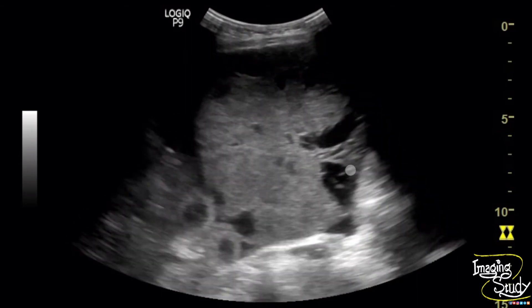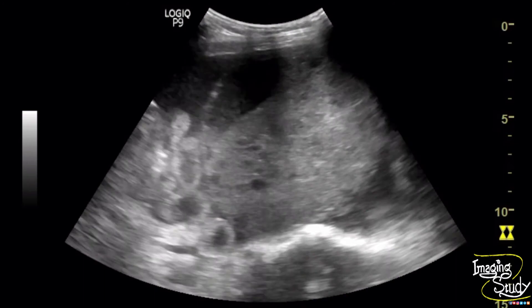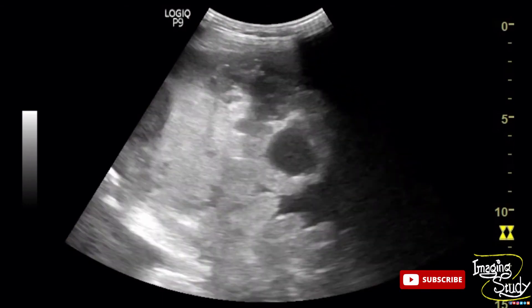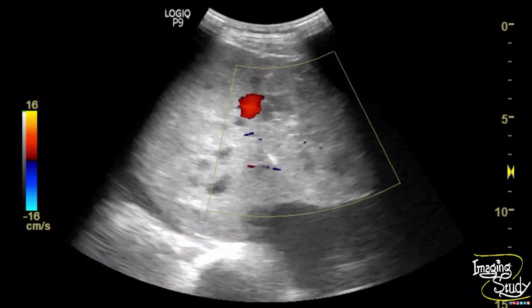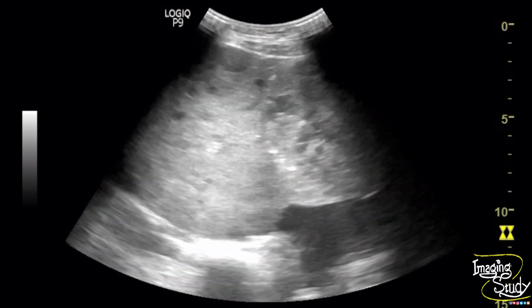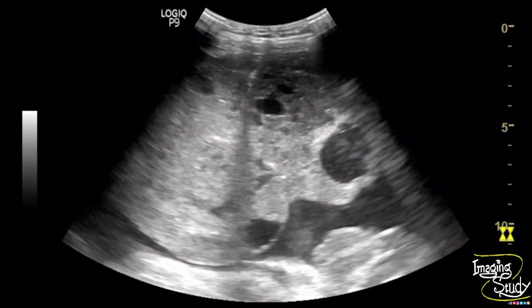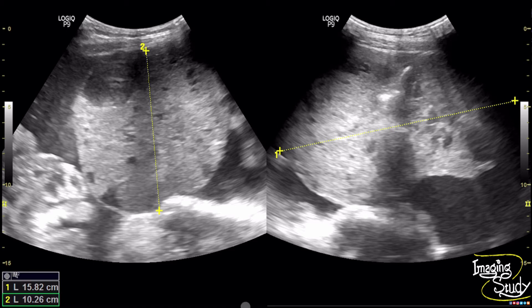Here again is the mass lesion with a predominant solid component, fat content, some calcified areas, cystic areas, and increased internal vascularity. The calcified areas are seen better here. The approximate measurement was around 16 cm by 11 cm on ultrasound, and the CT scan shows quite similar dimensions.